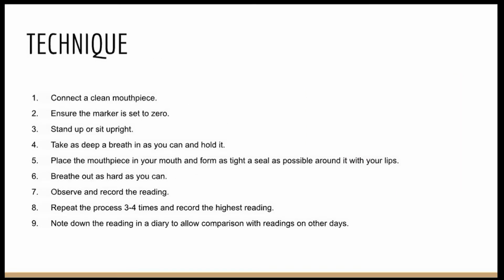Now let's look at the technique of using a peak expiratory flow rate meter. We must connect a clean mouthpiece to the instrument first, then ensure the marker is at zero. The patient should either stand up or sit upright, and be asked to take a deep breath and hold it.